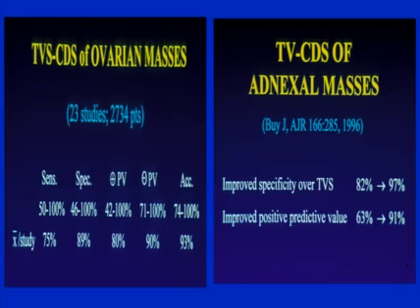Now, I must admit that these lesions do show significant variation in different studies, and some studies which included pre- and postmenopausal women showed various statistics. If one uses mostly postmenopausal women, the data, as you can see in the study on the right, shows much better specificity and improved positive predictive value.